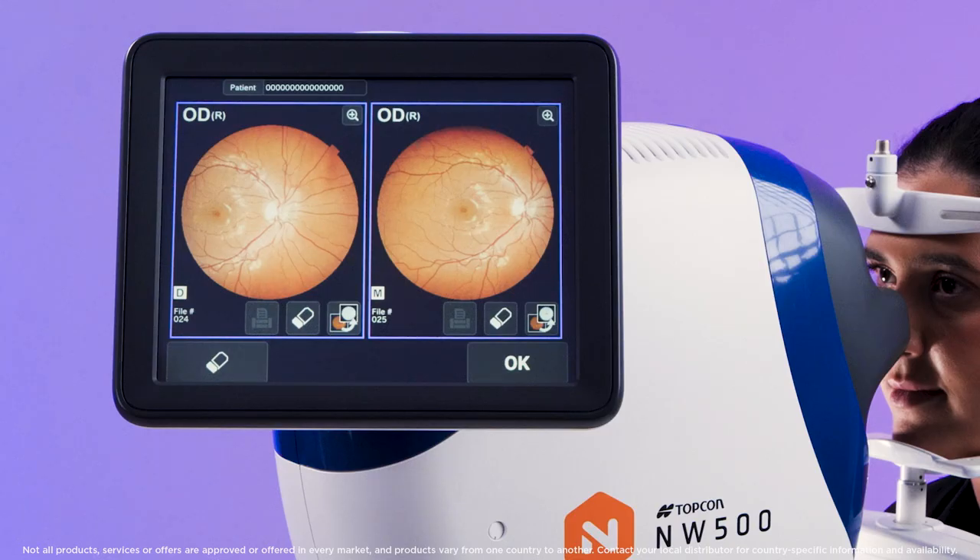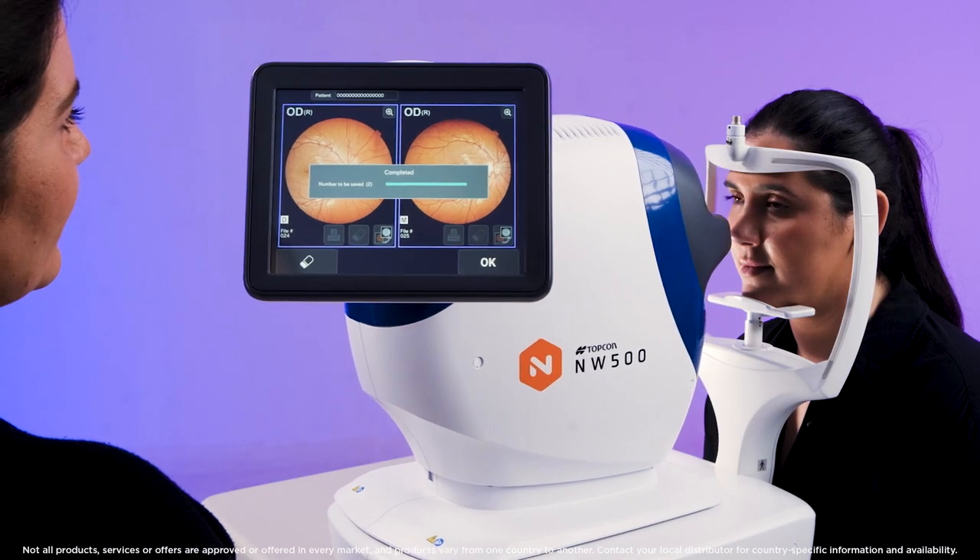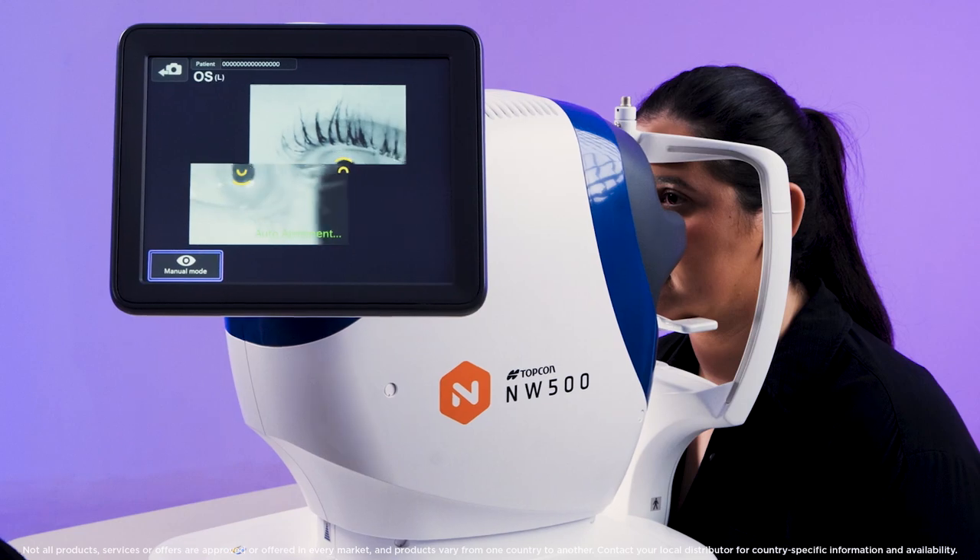Once this is complete, the two images will be displayed. Press OK to save. Then it will automatically move to the left eye.